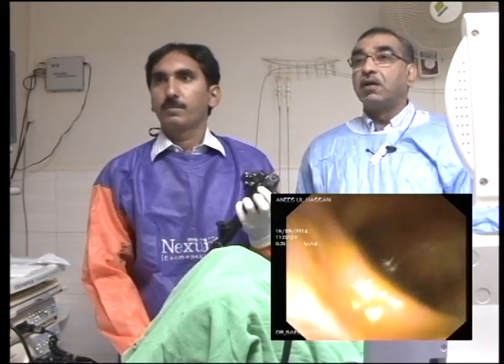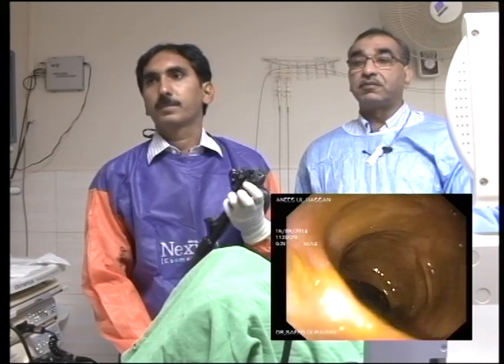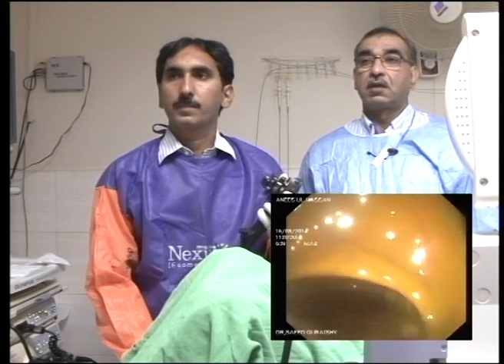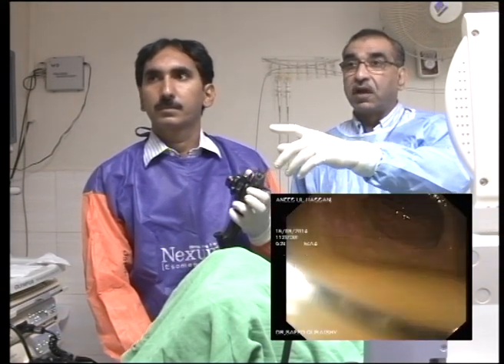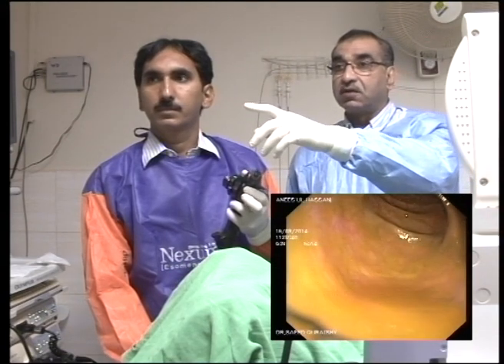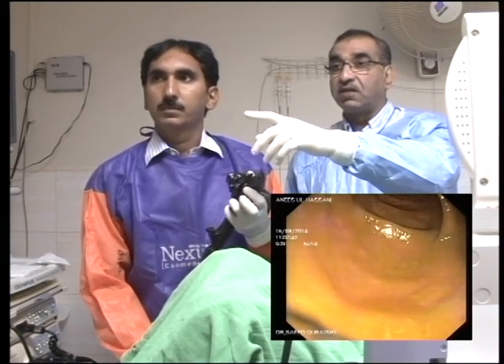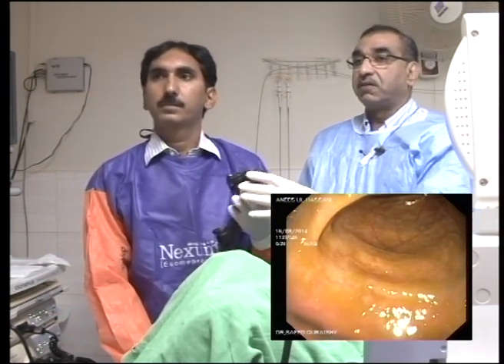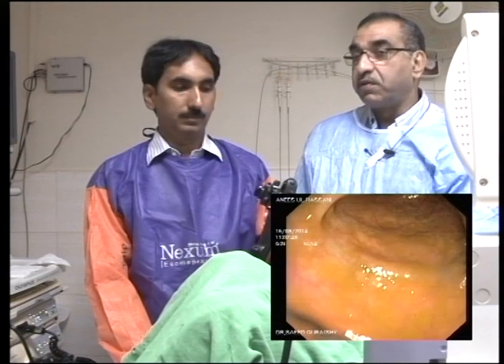Asha, as we approach, we are in the splenic flexure area. Insufflation is actually your enemy. Now just suck the fluid off. Always remember that your biopsy channel is at 5 o'clock position. So no, just wait a minute. Just let me show you.